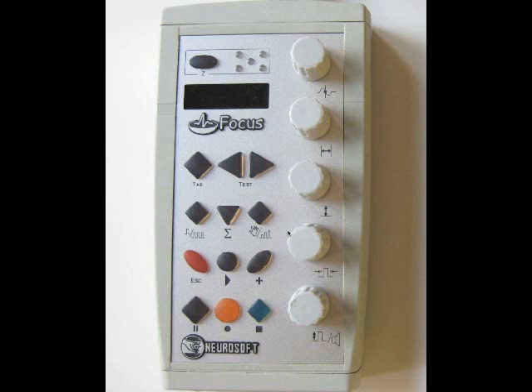There's a Sigma button here: if you're working with sensory potentials and not getting a good response and want to average it, you press on this and it will average it. The play button is for the needle exam — whenever you start the needle exam and want to see the sweep, you press play and it plays the sweep. If you want to pause, you press the pause button. To start acquiring needle exam potentials, you press the acquire button, and once you're happy with them you press store, and it will store them.